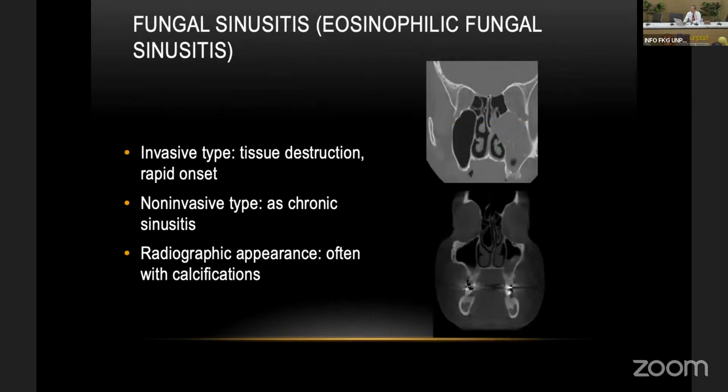Another sinusitis people should pay attention to is fungal sinusitis. If the patient has fungal sinusitis and is also immunocompromised, like with HIV/AIDS or sometimes diabetes, they may have more severe symptoms. Fungal sinusitis can cause bone destruction. So if you do not recognize this kind of sinusitis when you place an implant there, it is most likely going to destroy the bony structure around the implant.